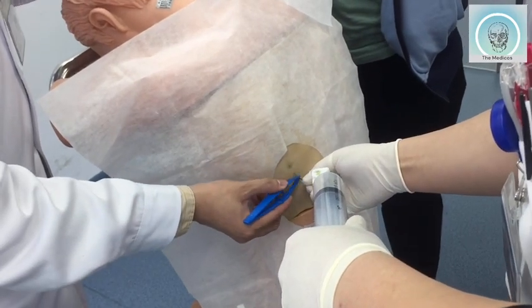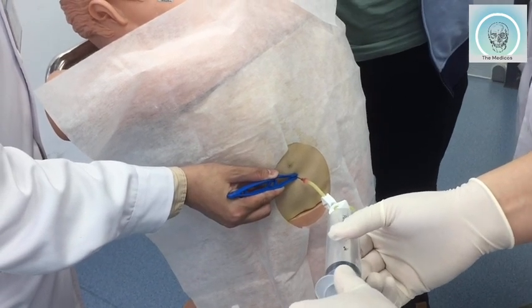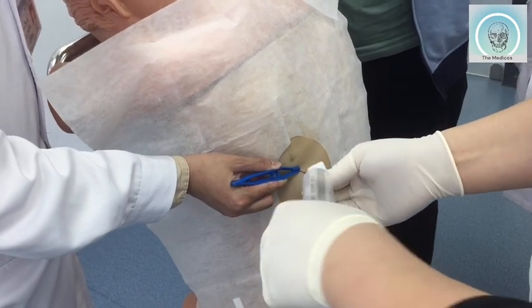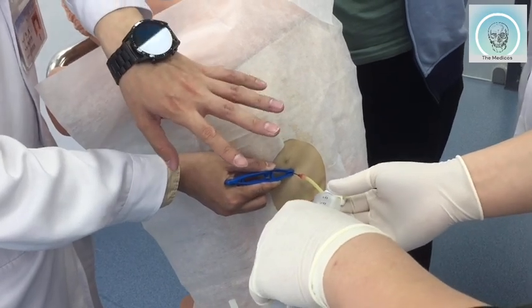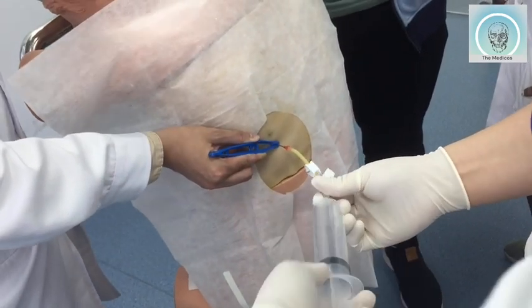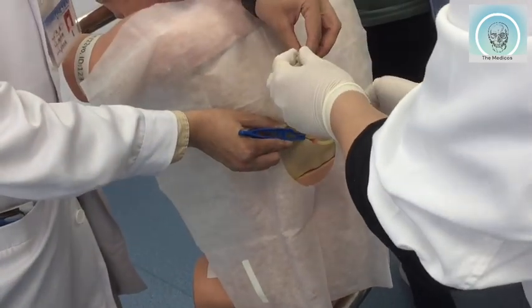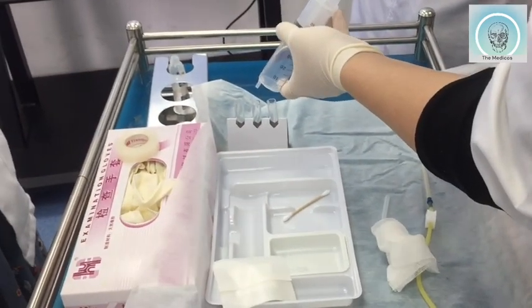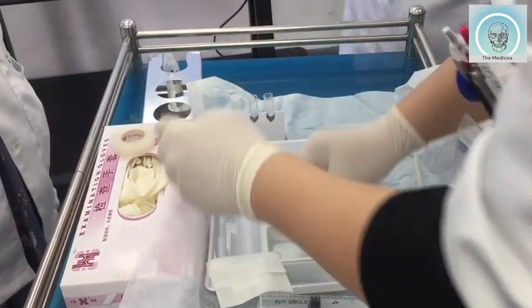Holding the system and collecting the effusion sample. And every time, the first time, you have to collect six milliliters. Once you take the syringe out, away from the tube, you should clamp it. Clamp the first one. Okay. Just put the fluid into different vials for the examination for the pathology.